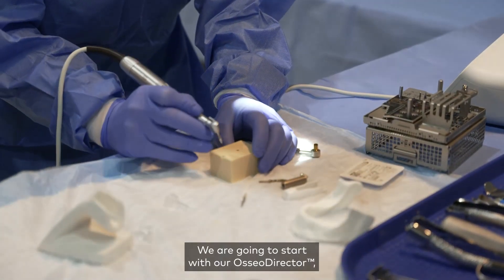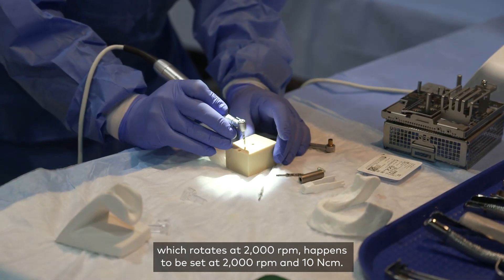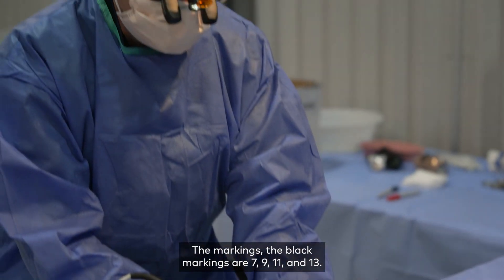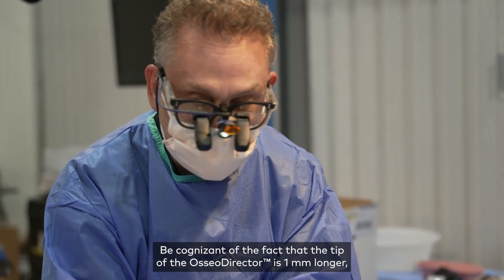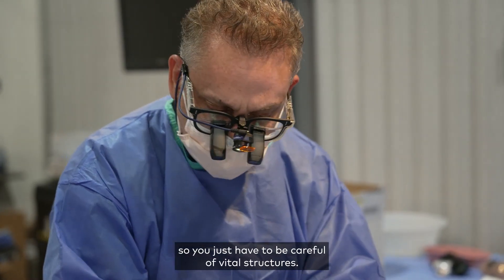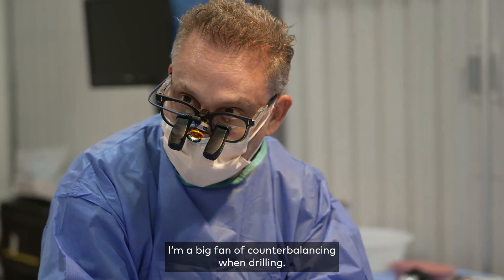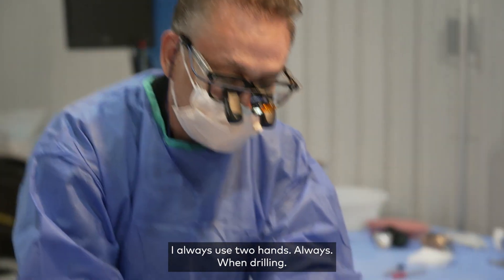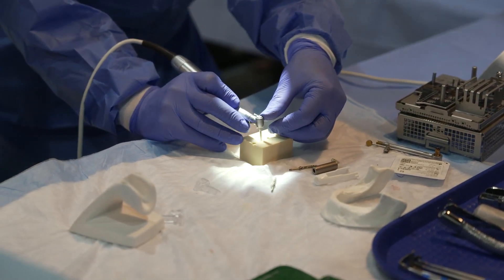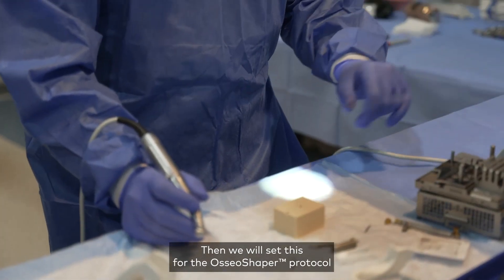We're going to start with our osseo director, which rotates at 2,000 RPMs — it happens to be set at 2,000 RPMs and 10 Newton centimeters. The black markings here are seven, nine, eleven, and thirteen, but be cognizant of the fact that the tip of the osseo director is one millimeter longer, so you have to be careful of vital structures. I'm a big fan of counterbalancing when drilling, so I always use two hands. I'm going to drill this to about 11 millimeters, which is the bottom of the second black marking.